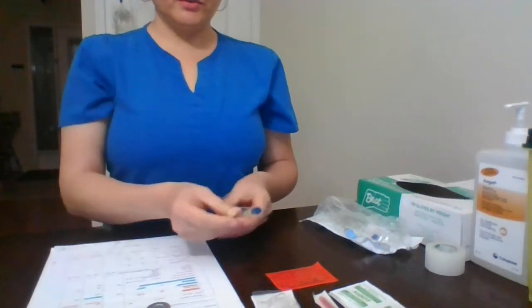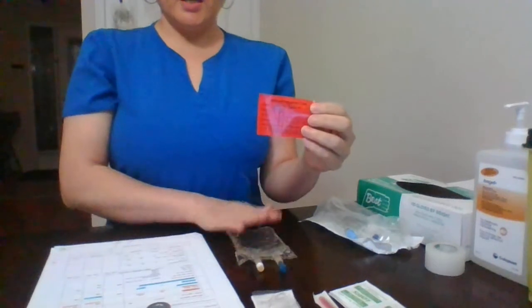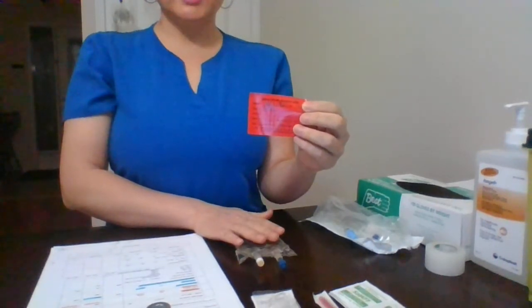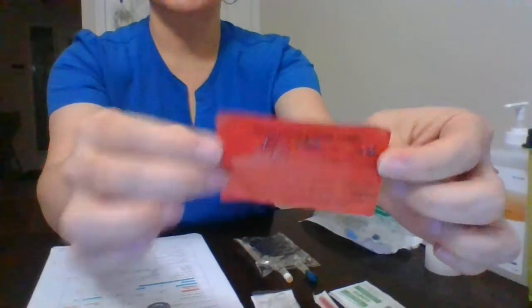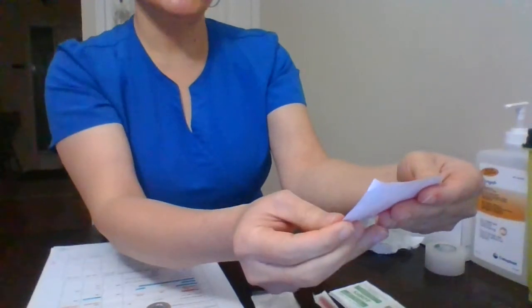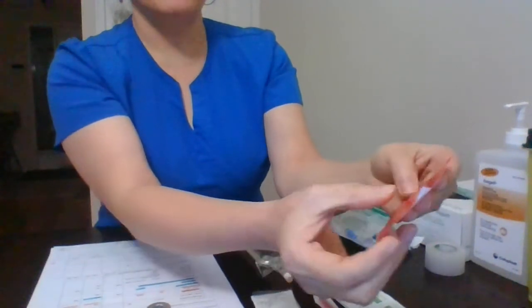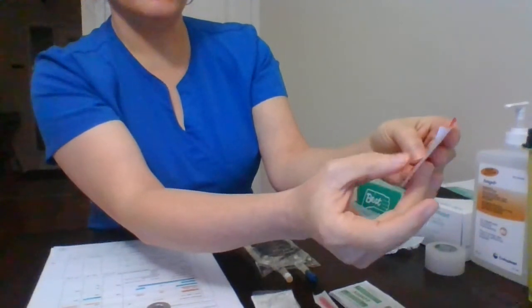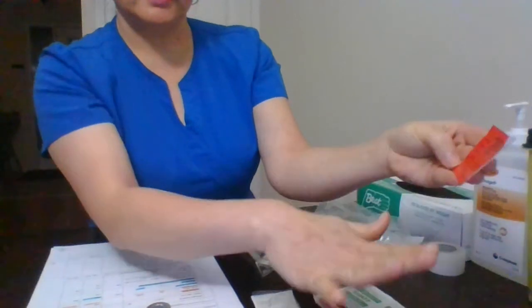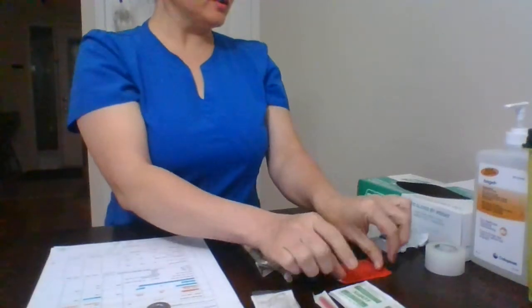And the other thing I will do during this time, I also have my label that I need to put on my mini IV once the medication is inserted inside. So I have filled up all the information. I have the patient's name, room number, name of the drug, which is pantoprazole. Amount is 3 ml, added by myself, KN. The solution base is 50 ml. Date is today's date, and then the time and flow rates according to our calculation, which I've already done.